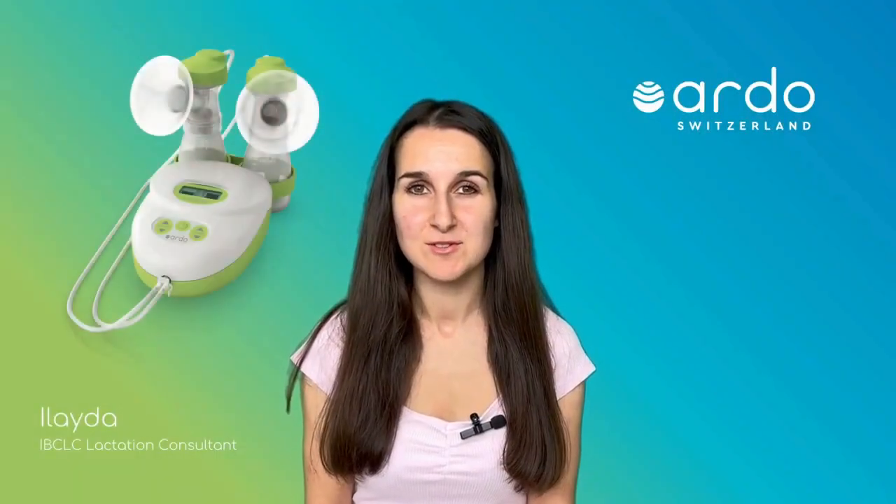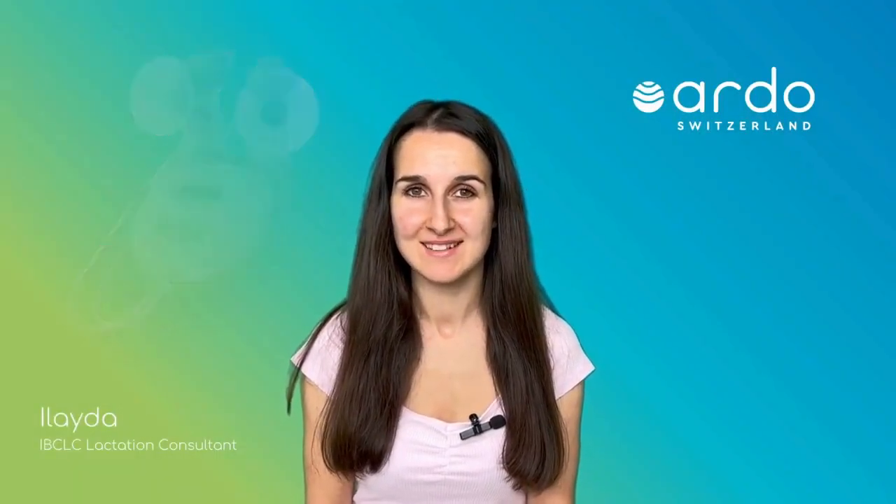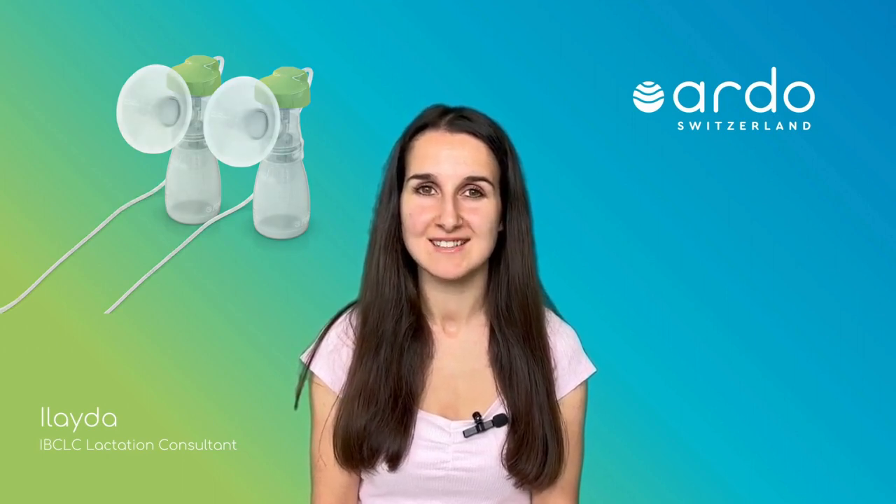In this video we're going to talk through troubleshooting the Calypso brass pump. First of all we need to make sure we are using an Ardo Original pump set. Other pump sets may not fit together correctly, affecting the way seals and connections happen, which will then affect how the pump works.